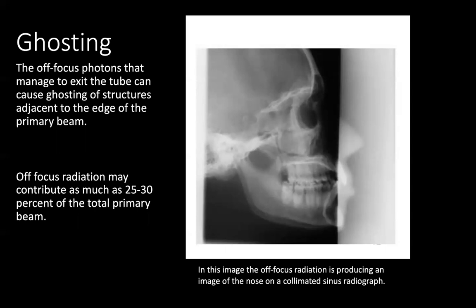It is undesirable because it extends the size of the focal spot and can significantly reduce image contrast. It images patient tissue that was to be excluded by the variable aperture collimators. Examples of these images are the ears showing up in a skull examination, the soft tissue beyond the cervical spine, and the lungs beyond the borders of a thoracic spine.